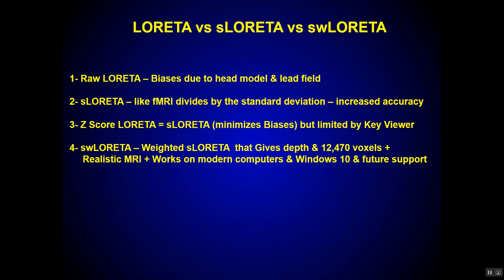That has to do with the smoothness of the current density. It makes assumptions about simultaneously active generators, so that neurons actually cooperate in large numbers to generate currents in synchronous groups. If you make that assumption, then the Laplacian is one of the physiological constraints that allows you to get an exact linear solution to that equation I just showed, because it is consistent with the underlying physiology, that is, the underlying way in which neurons behave.